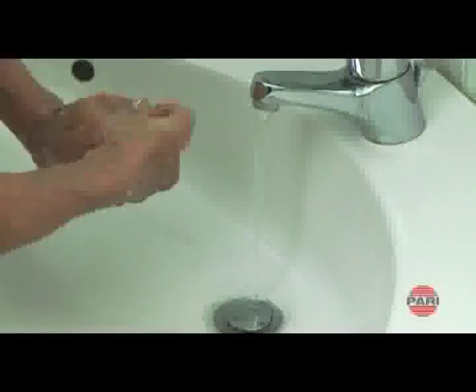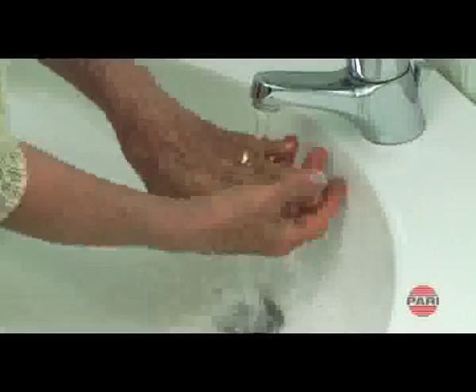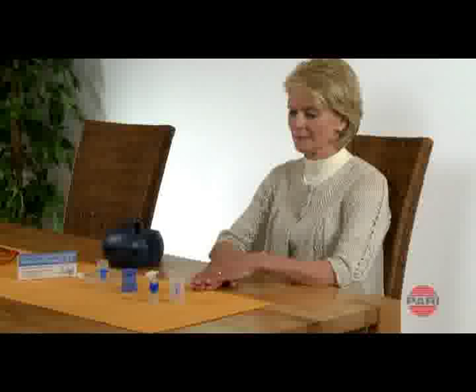Please wash your hands first, because even healthy people have microorganisms such as bacteria on their skin. Before starting a nebulizing session, the compressor should be placed on a firm, dust-free surface, ideally a table.